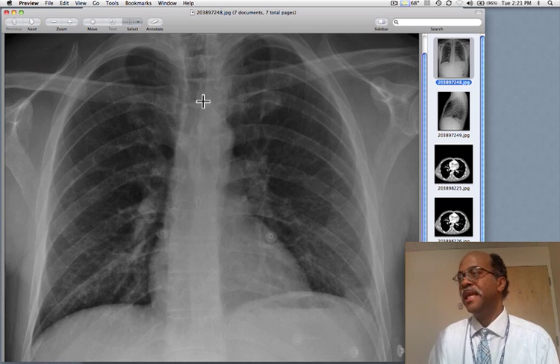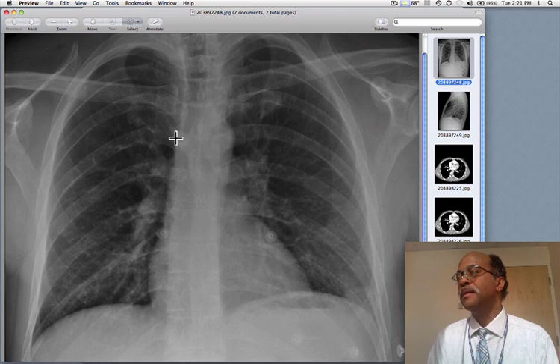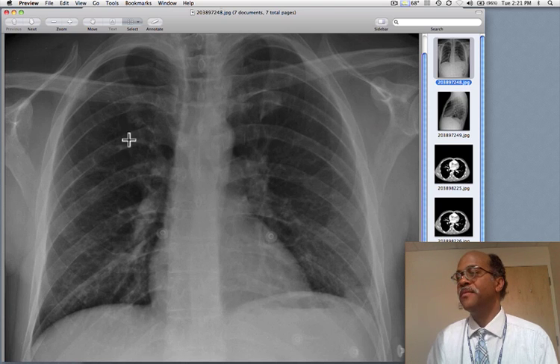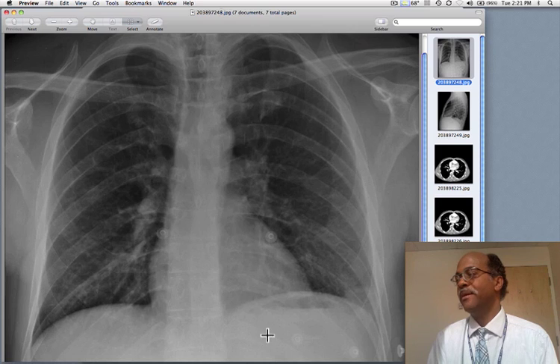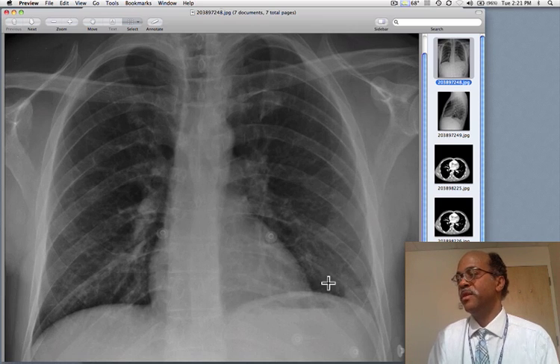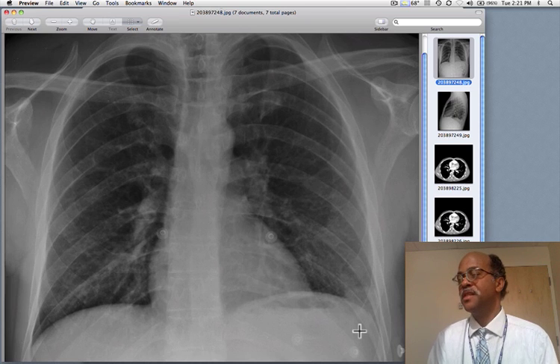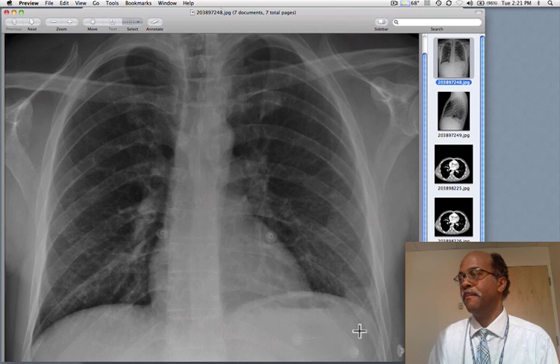We can see here that the lungs — we want to compare them side to side and look for any asymmetry of opacity. We can see that there's an asymmetric opacity at the left base, and as it turns out, that's exactly where the patient's chest pain was located.